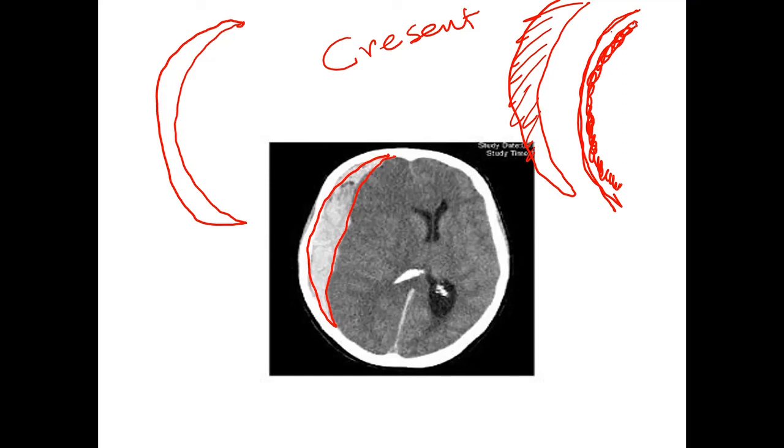So a subdural hematoma presents with a crescentic shape or concavo-convex appearance. For this particular image, you have an acute subdural hematoma. You can see a midline shift. You can see bleeding into the ventricles. And here there's almost effacement of this.